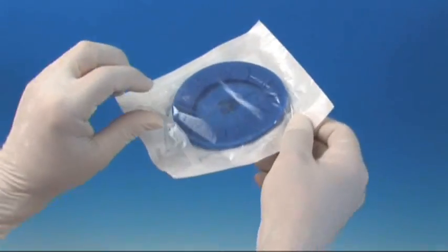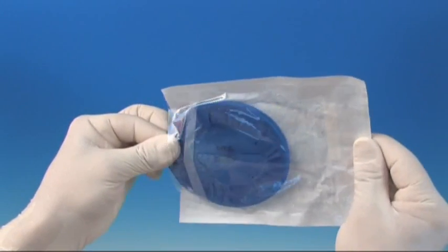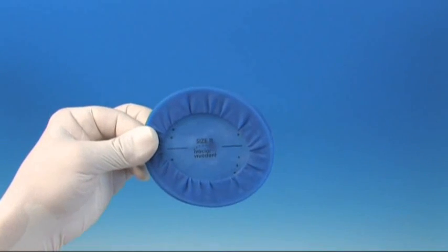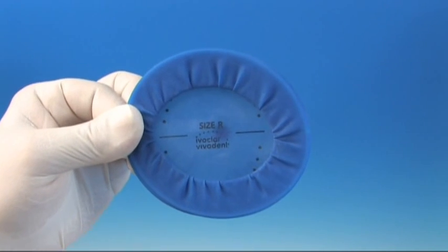Selecting the correct size is very important to ensure unrestricted function and perfect fit during treatment. Impression tray sizes may be used as guidance. Select Optredam size regular for impression tray sizes M and L. For impression trays sized S, select the size small.